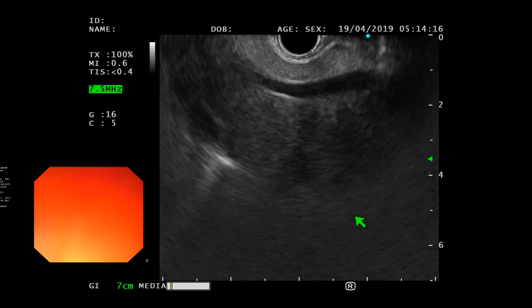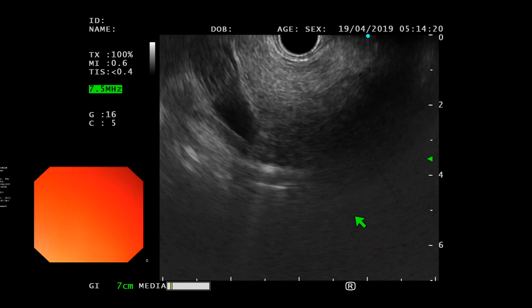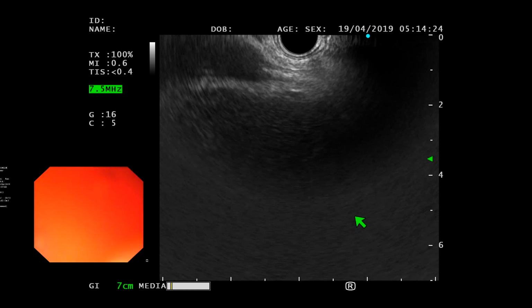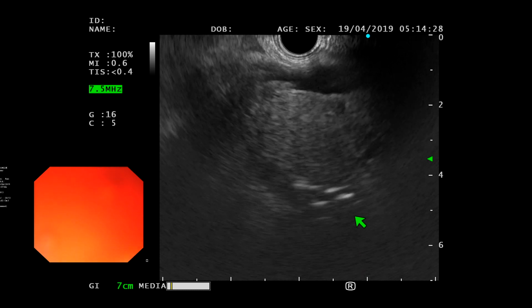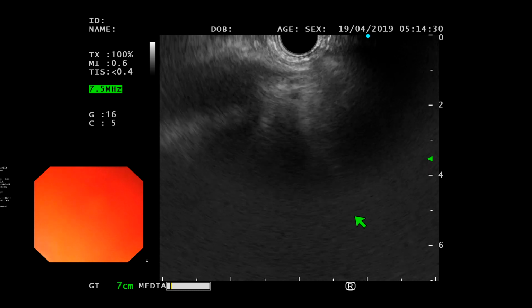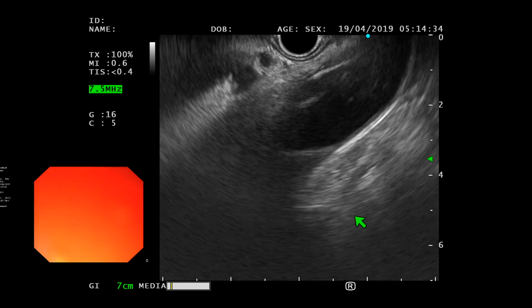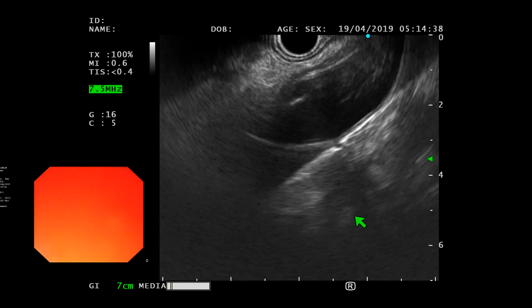Sure. So the other thing is, more than one maneuver can work in a situation. Here, what I tend to do is have my trainees look at the endoscopic view and go anti-clockwise with their left hand and see the gastric folds. You've got the diaphragm, you've got that. Okay, happy with that?